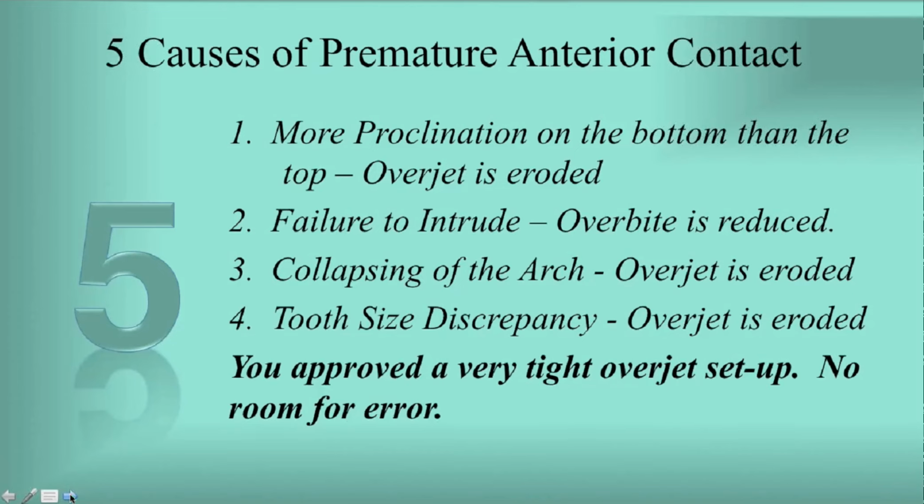When I do a reconstructive case or a cosmetic case, I'm going to have more room for anterior guidance than what we normally think of, say, as a denture setup. And yet the orthodontic model is closer to the denture model than it is to the restorative model. And so I have to approve a setup in ClinCheck that has more room for anterior guidance.